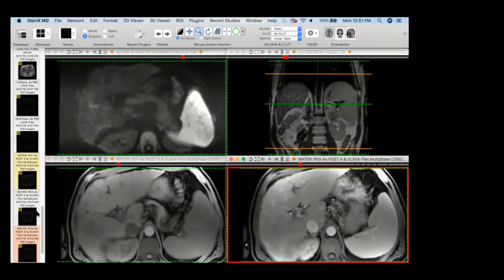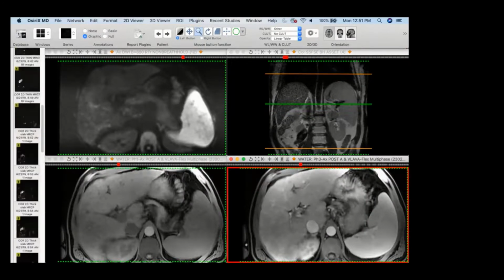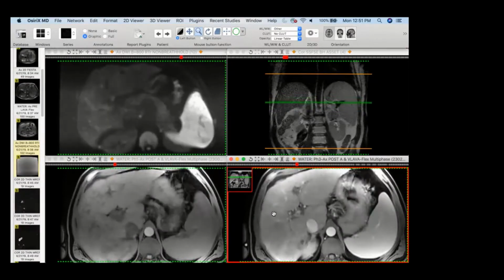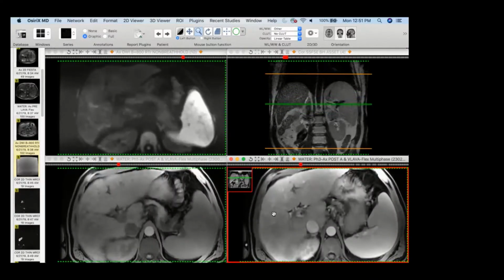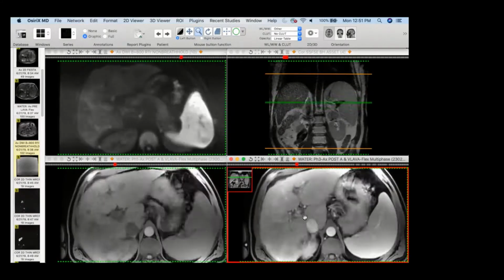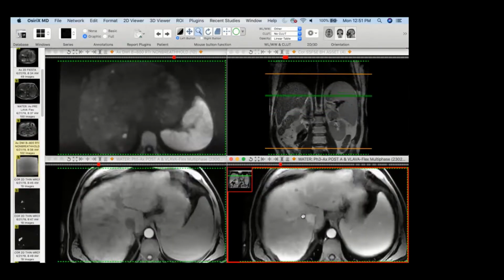I was just wondering about abscesses and pylephlebitis and stuff. Patient is asymptomatic. That's a great DDX. Clinically, he didn't have evidence of infection. That left portal vein is thrombosed. It's gone. Yeah, the whole left portal vein is gone.